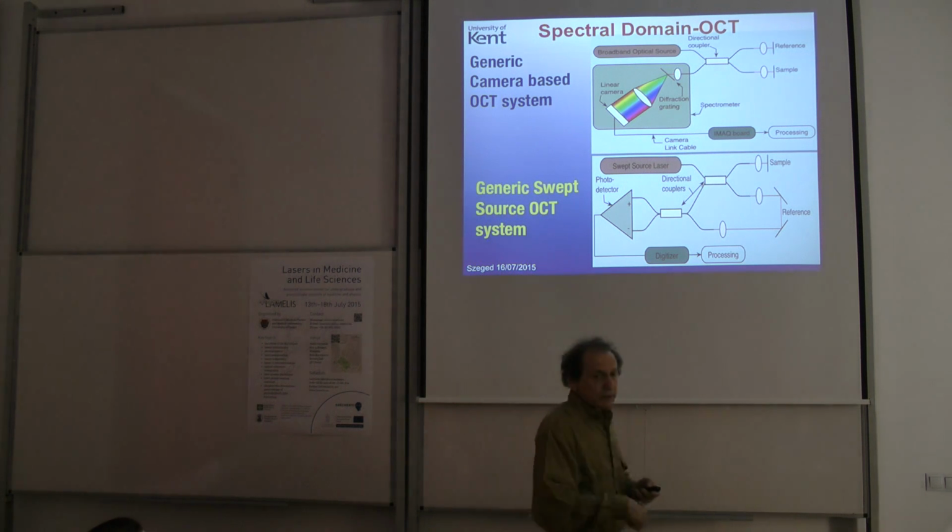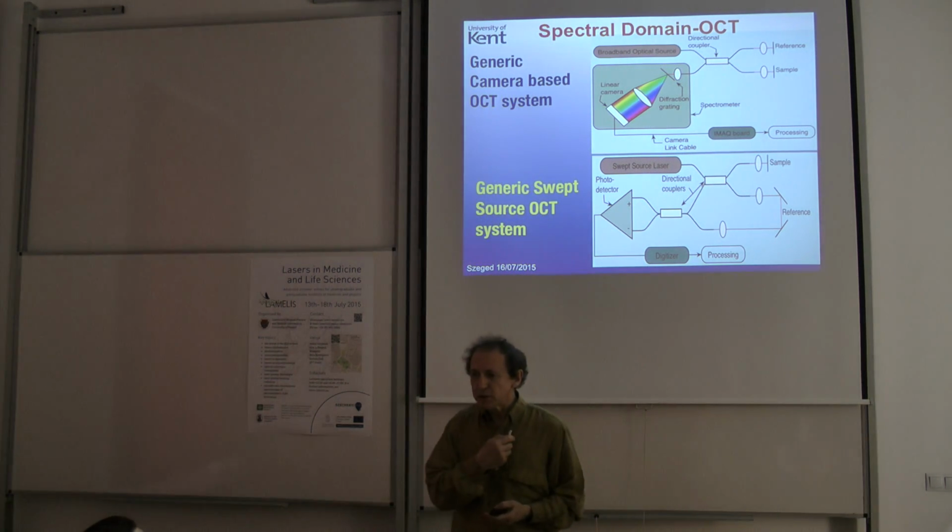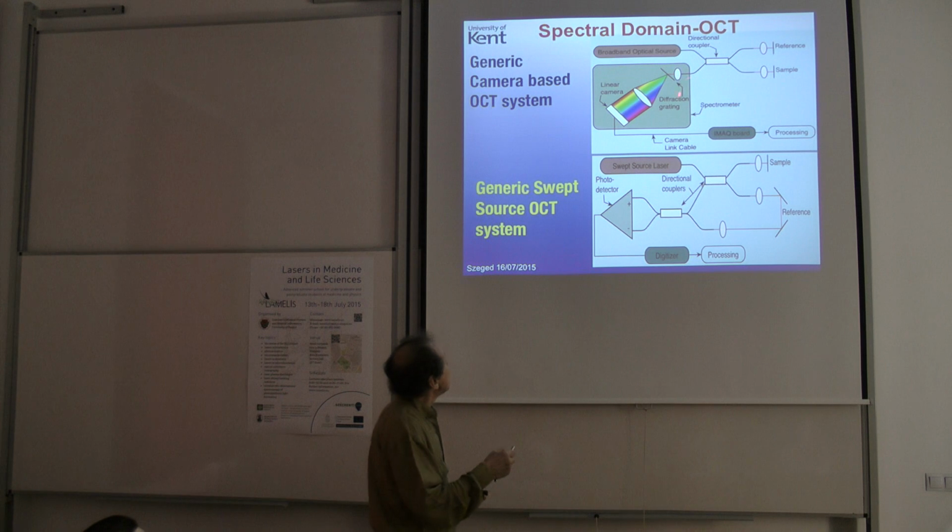Let me now go more into the modern technology, which is these two. I have already alluded to this. Let's review them again. So, you have an interferometer. From the source, sample back. From the source, reference back. So the two waves go in this fiber, and they superpose, and now we display the spectrum of interference with a lens and a diffraction grating. Diffraction grating, lens, and the camera. So you have here the spectrum. That modulation which I presented before will be here, over the camera.